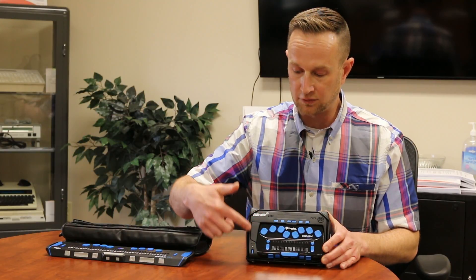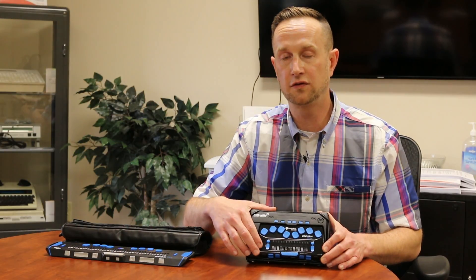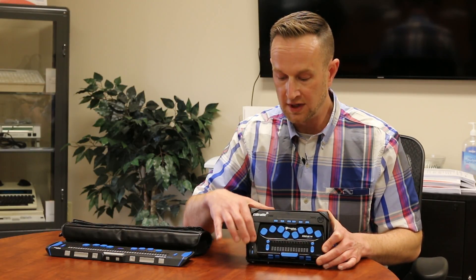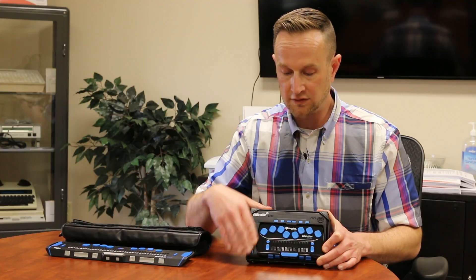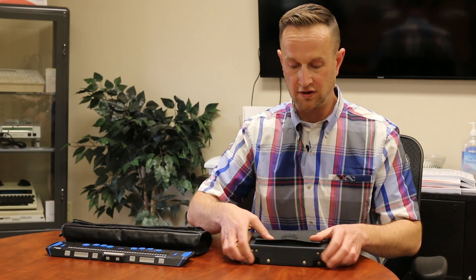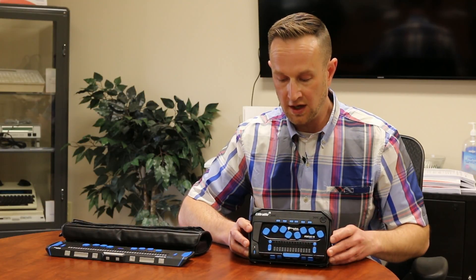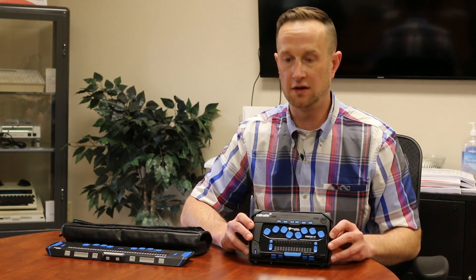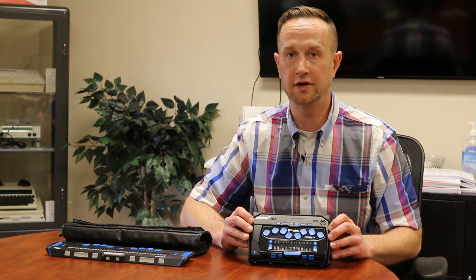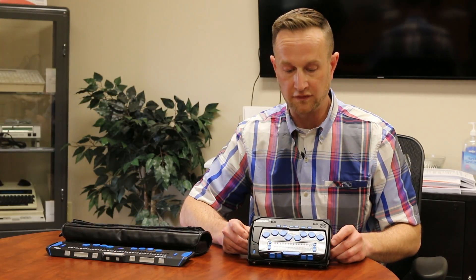The Braille display docks right into the L Braille itself. The Focus 14 is a Braille display that has been out for several years, but the L Braille is brand new. Together this is the package, and it comes with a nice little carrying case as well, so it can be portable and protected. With the L Braille you have full access to anything you could do on a computer, right there with you in a nice portable device.